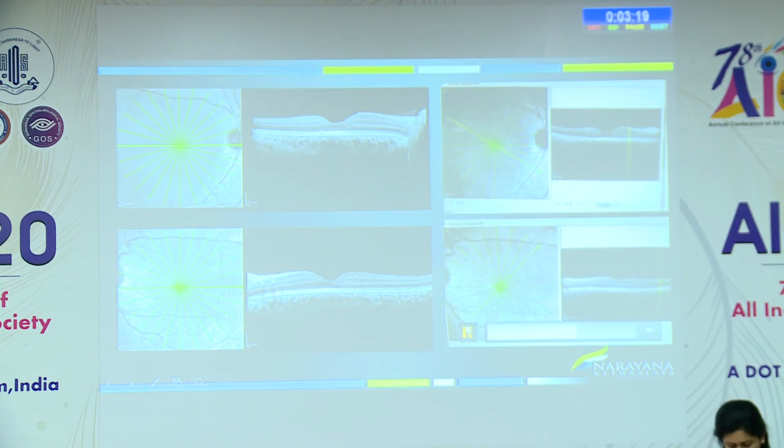No foveal defects. This is the first case of achromatopsia which at least I have seen with no structural changes at all in the fovea. Absolutely normal. So she is applying for divorce. Maybe this ERG will help us.